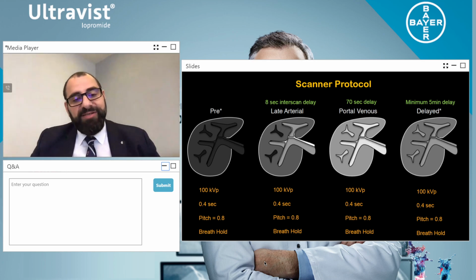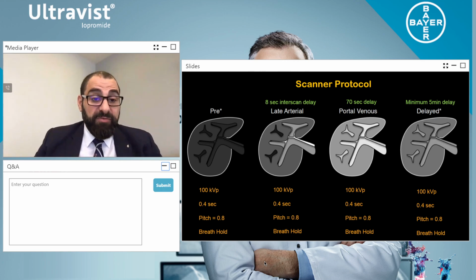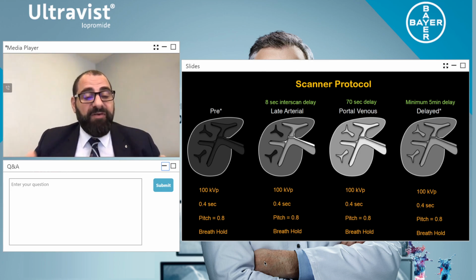Because remember, the liver, we're only scanning a small section of the abdomen. And we always want the pitch values to be exactly the same. Now, if we also look at the breath hold, make sure the breath hold's exactly the same. And then now let's look at the delivery. You want an 8-second interscan delay. So if you're doing bolus tracking, you put the region of interest at the top of the liver, and as you're injecting contrast, once it reaches there, within 8 seconds, we should have an interscan delay, because that gives enough time for contrast just to start coming back into the liver.